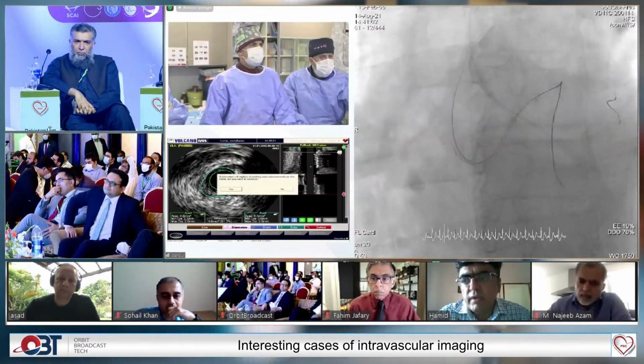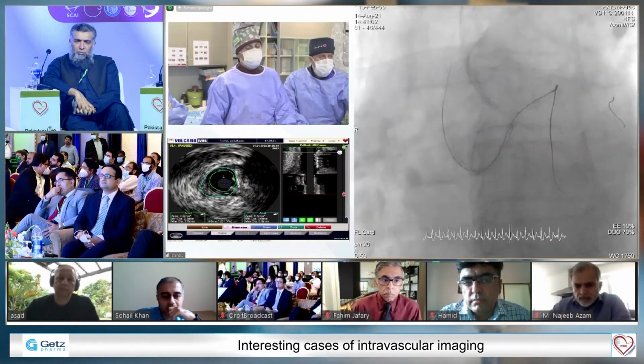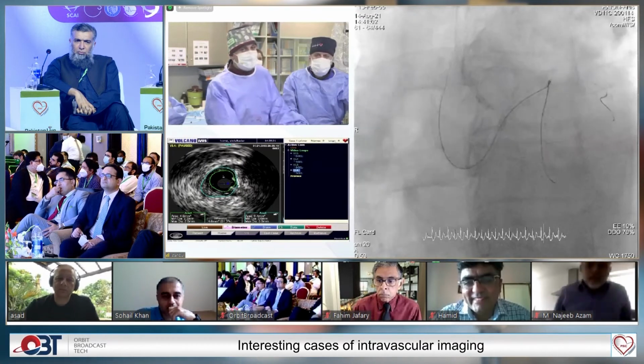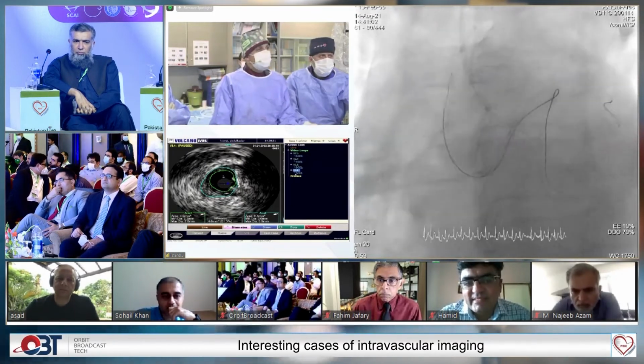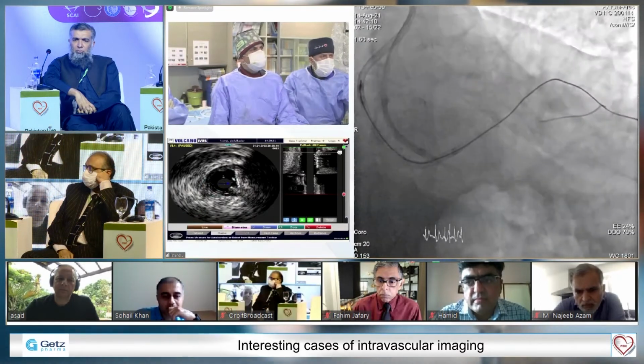You can even snare it if it is difficult getting in. That's true, but sometimes snare is not easy too. As you know, it takes 5 minutes, 15 minutes sometimes, at least in my hand. But you are right.